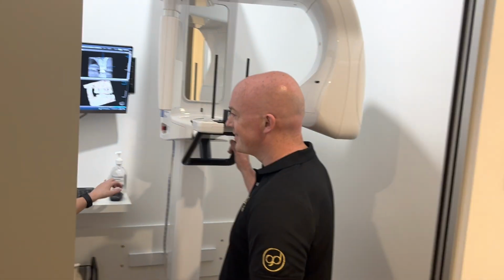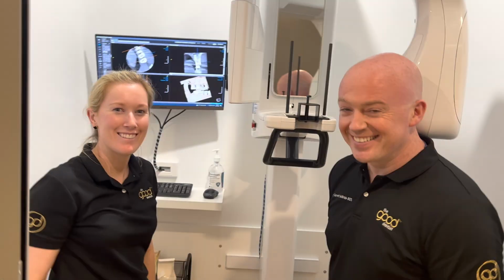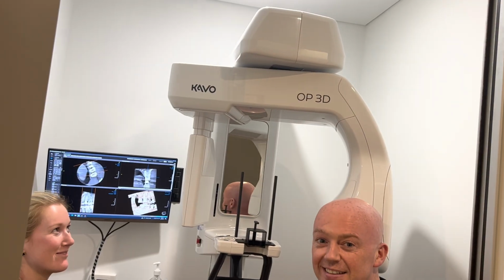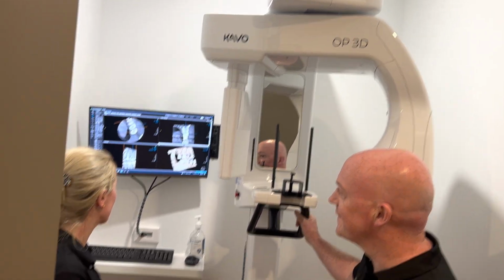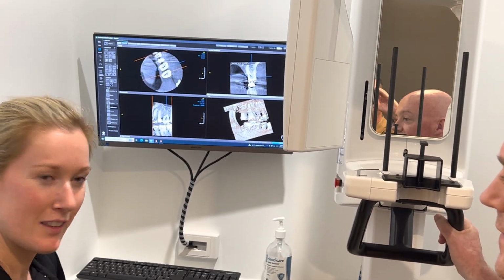Here we have my favourite client, Dr. Gareth McBride, and Amy. How are you going? Hello, how's it going? Good. We're here having a look at what they're doing with the KaVo OP3D. I was hoping to have a look at one of your cases, Amy, just to run us through what you found on one of your cases.